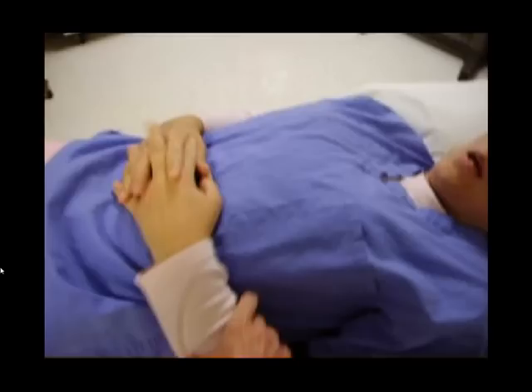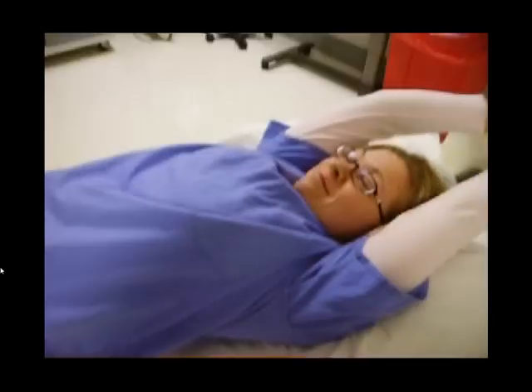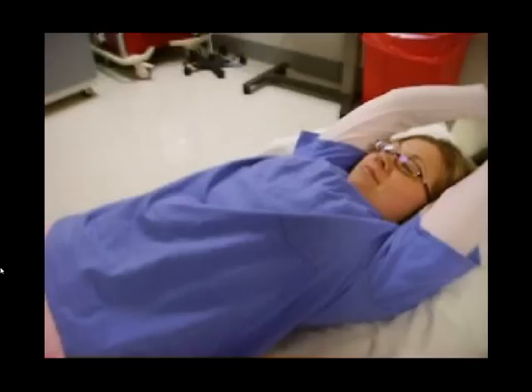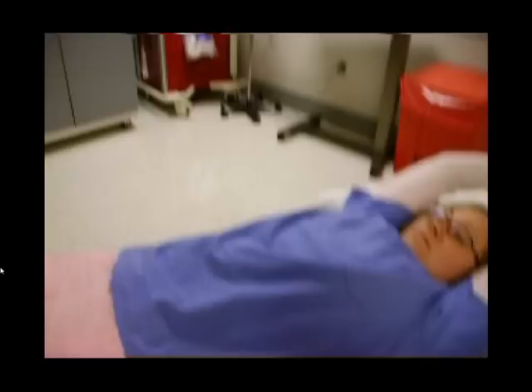And you want their arms up over their head and out of the way. Now, some elderly people are not going to be able to do this. One of the things that you can do is have them put their hands on the gantry and let their arms move with the gantry. Or if you have to, you can have them down by their side, but you want to try not to do that because it can lead to a lot of streak artifacts.